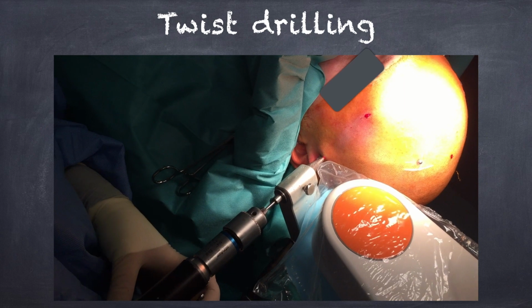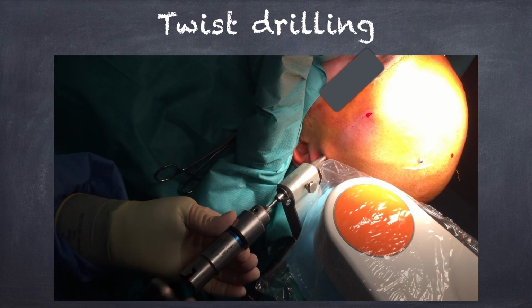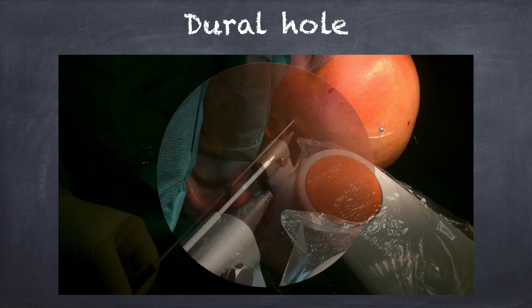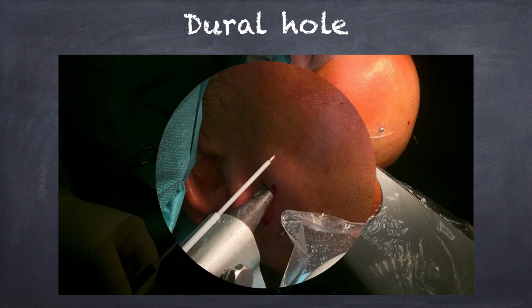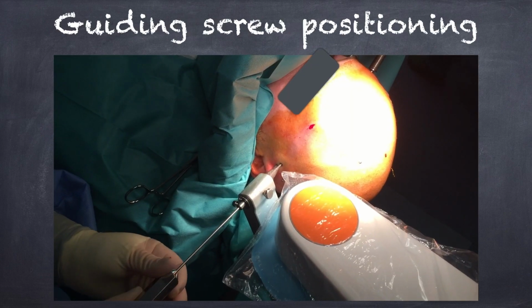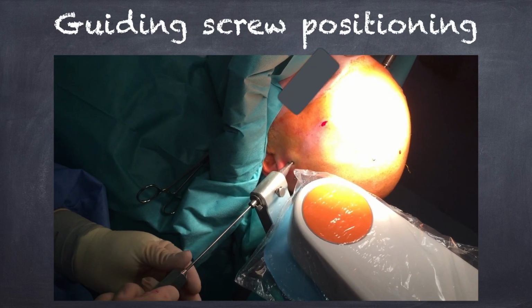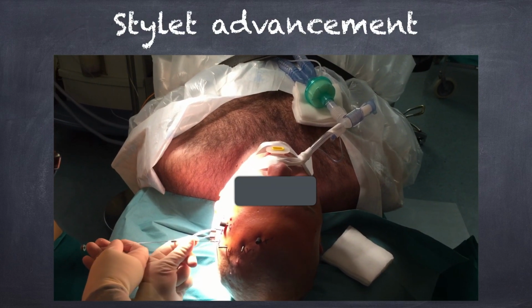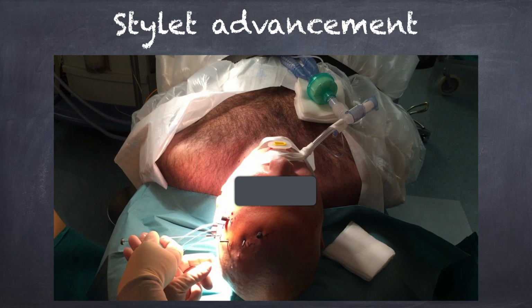The skull is twist drilled percutaneously. The dura mater is opened with the monopolar coagulating electrode. Then a guiding screw is advanced into the skull. Once all the guiding screws are positioned, the electrodes are implanted under X-ray control.